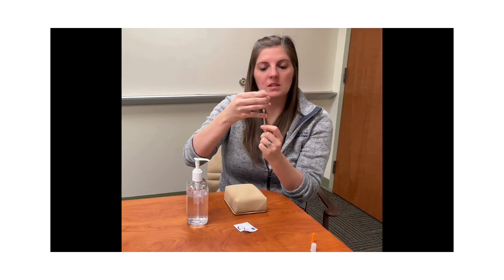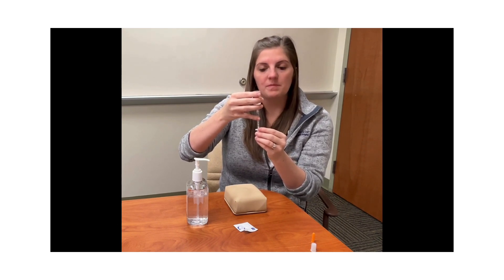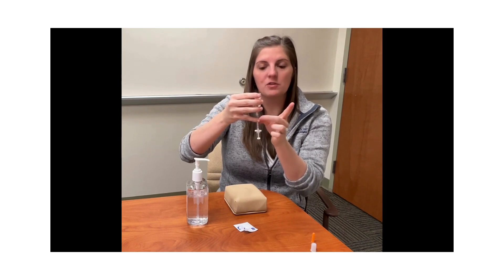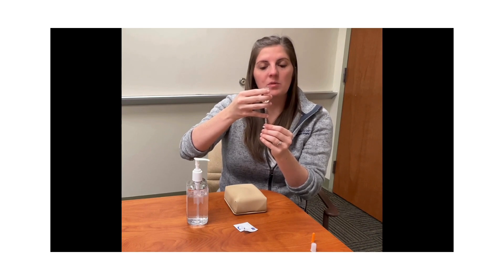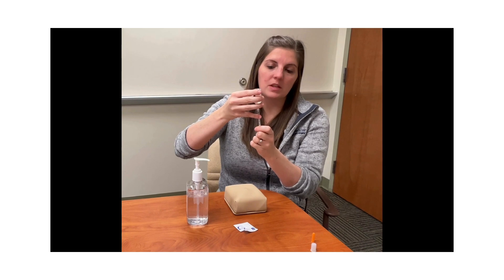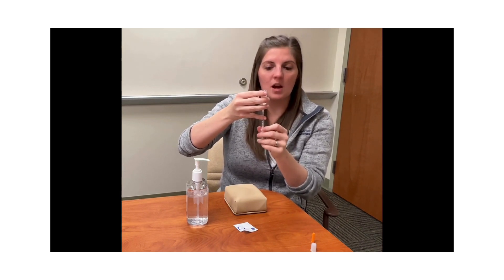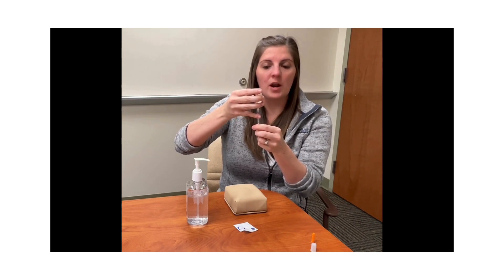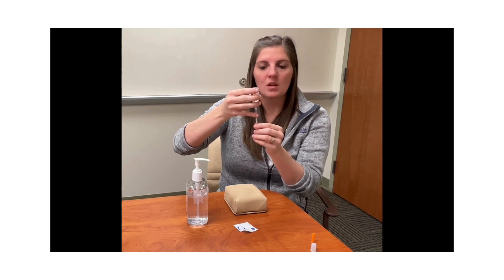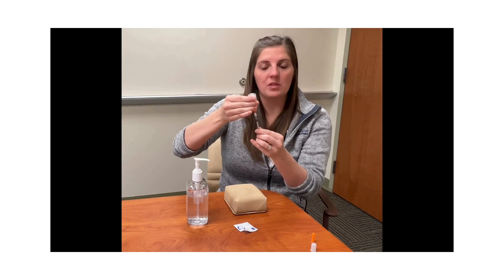Once you have the insulin in the syringe, make sure that there are no air bubbles. If air bubbles are present, you can tap the side of your syringe while holding the vial and syringe straight up and down, allowing the bubbles to float to the top. Some people will draw back an extra unit or two of insulin, tap the side to get the air bubbles to the top, then push the extra insulin back in. When you are happy with the number and there are no air bubbles, you can separate the syringe and the vial.